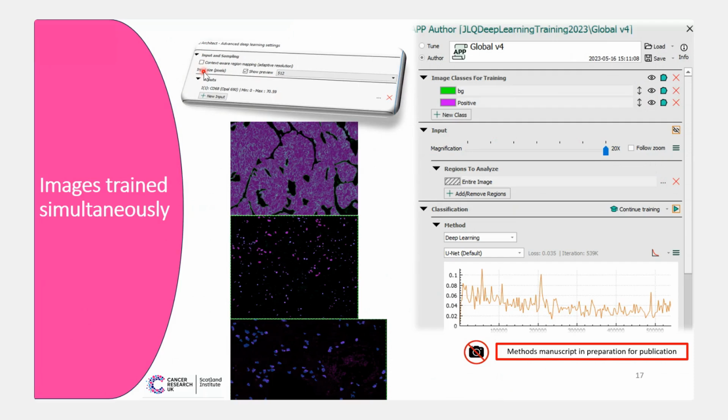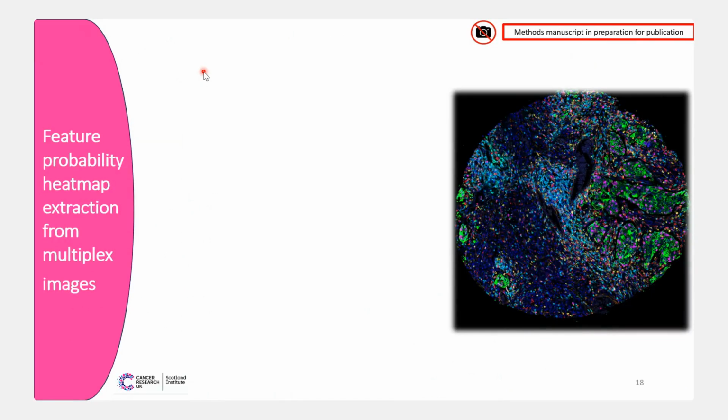It's going to look at what a cytoplasmic stain looks like, what a nuclear stain looks like, and what a membranous stain looks like. It doesn't really matter what the stain or what the marker is. It's just looking at the pattern, essentially. And then we trained it over 500,000 times with a good loss. We adjusted our freeze depth every 20 or 30,000 iterations as we saw fit. And yeah, so this is the output.